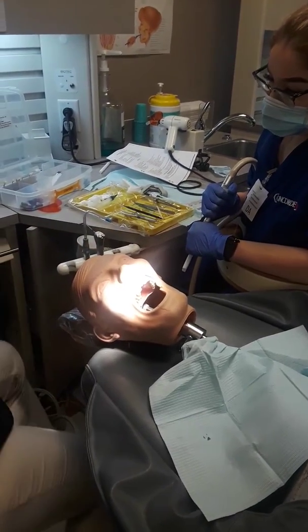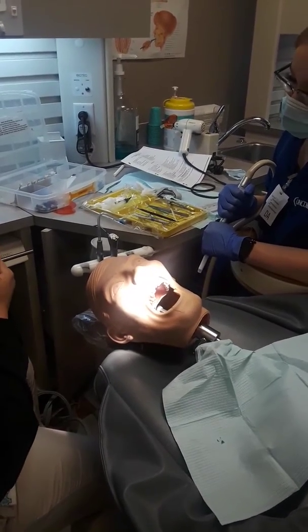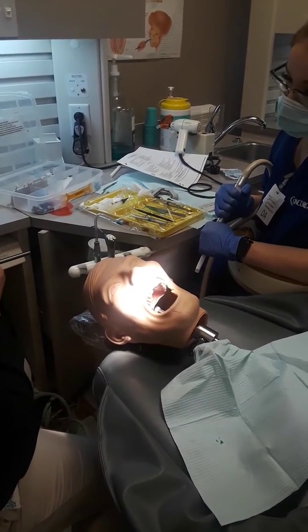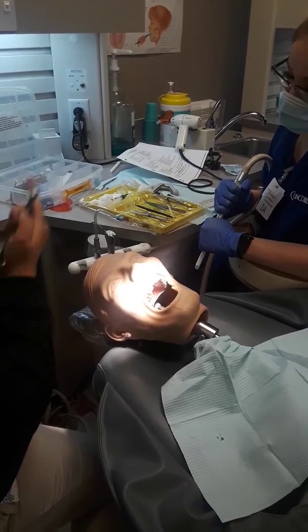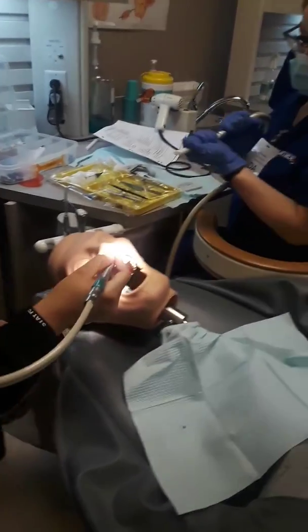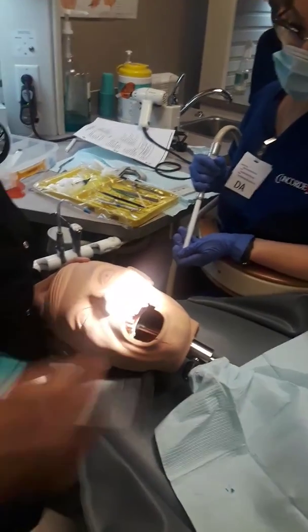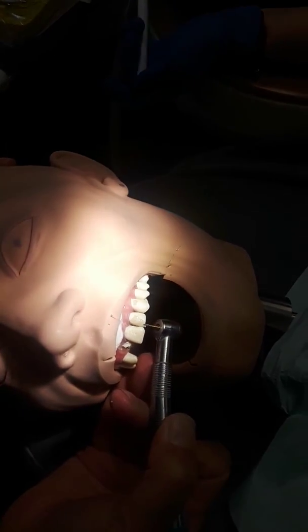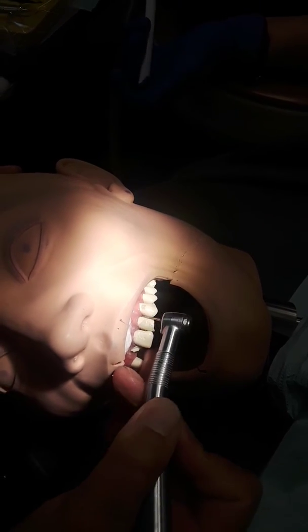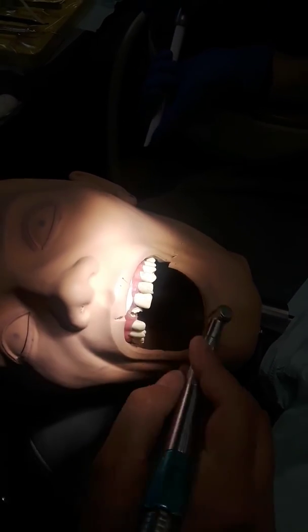Don't drop your instruments with a real patient. I'm going to adjust my facial surface as much as I can. The incisal edge is a little longer — I need to adjust that off and make sure my lingual is even as well.